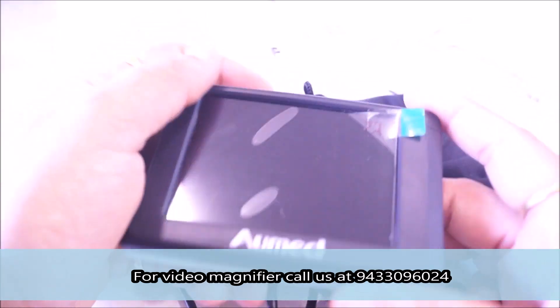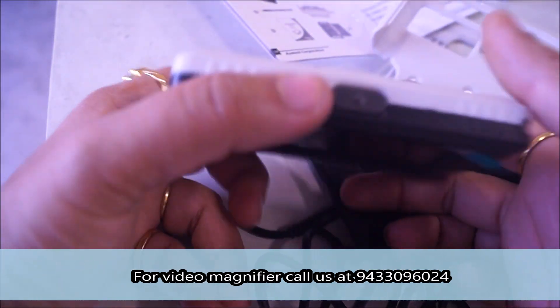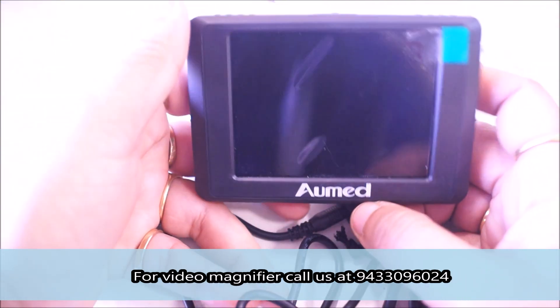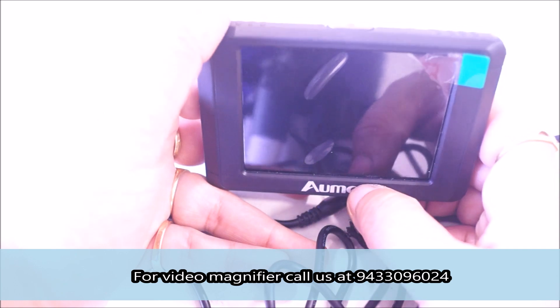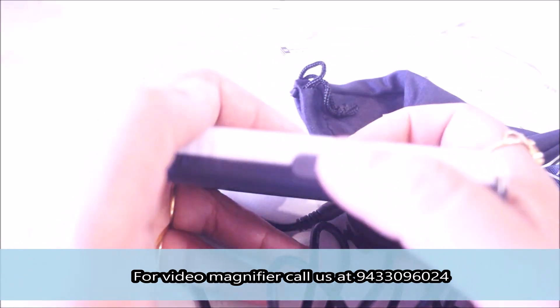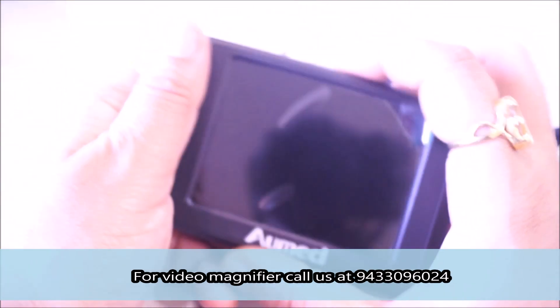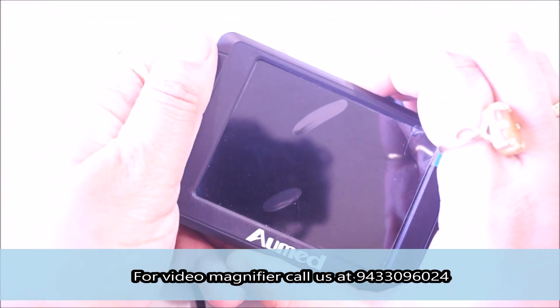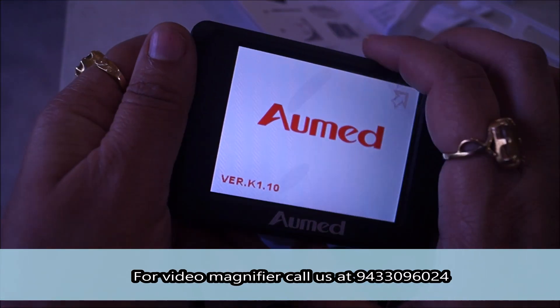Hello friends, let me give you a demo of this machine. It is called a video magnifier. If you want to start it, you will see the company name written, and above this position you will see the switch. By pressing this, it will start. The machine has started.